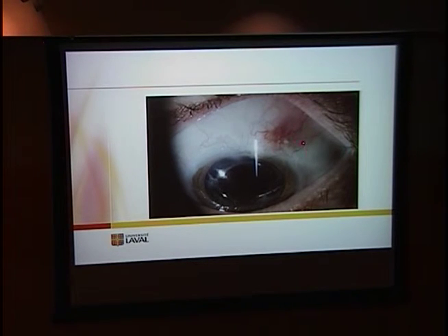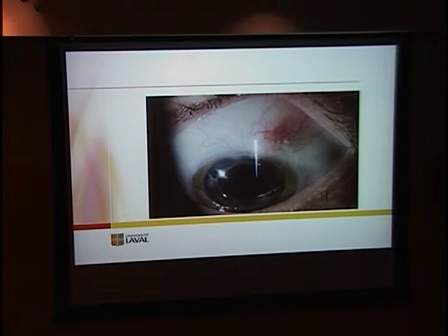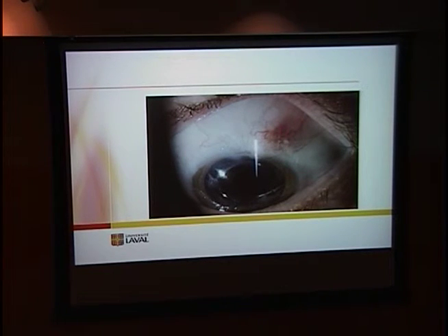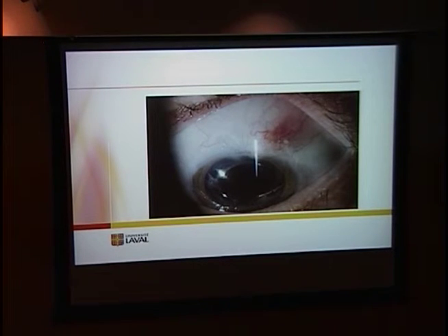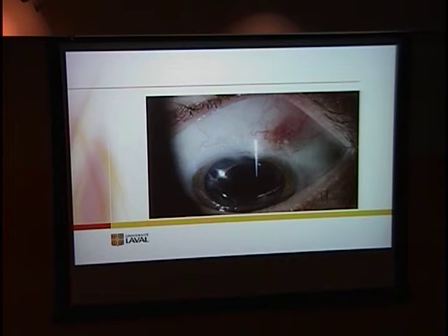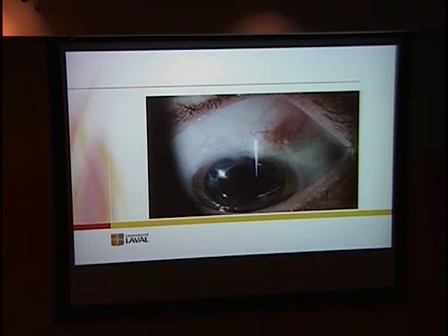This is my only case of a corneal infiltrate at the site of the transconjunctival suture. Since the pressure was good, the vision was good, and the eye was inflamed only locally with no pain, I treated topically with an antibiotic and monitored closely to be sure nothing was getting worse. It disappeared. It may have been infectious or inflammatory — I did not culture it because it was so small and limited.